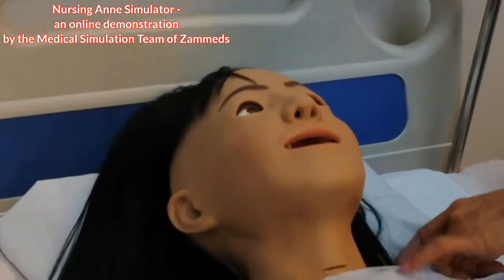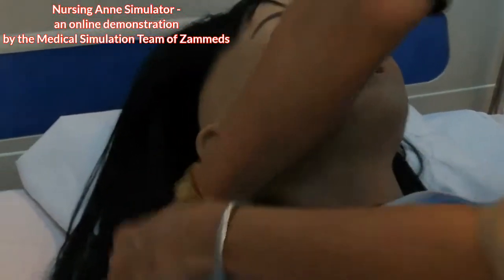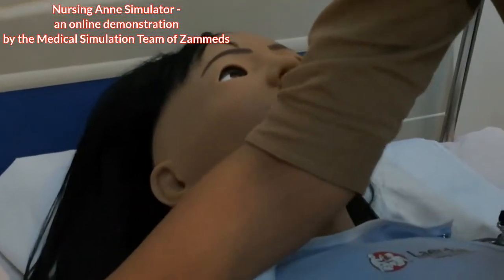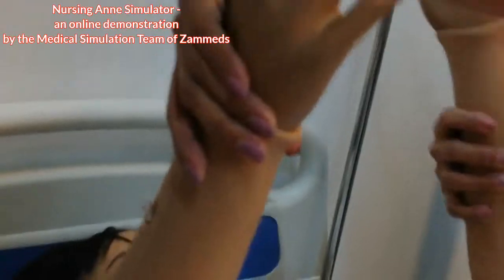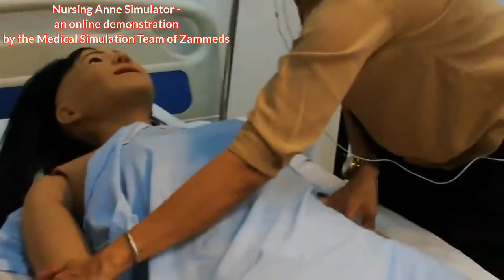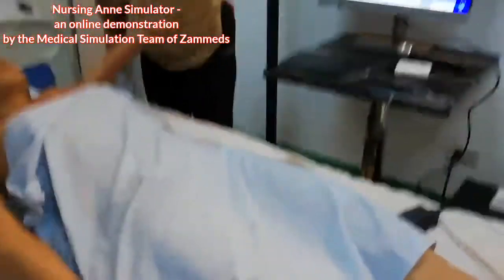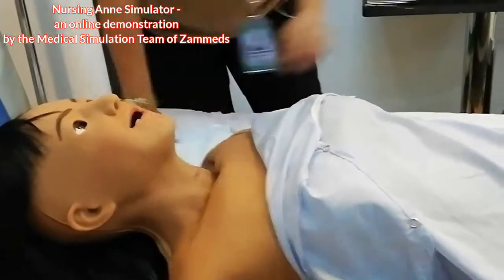Let me open her gown. As you saw in the video earlier, it is very realistic and can be articulated. She can be sat up, though she is a bit heavy. Here is her tracheostomy — going to the throat area — and she can be used for tracheostomy procedures.